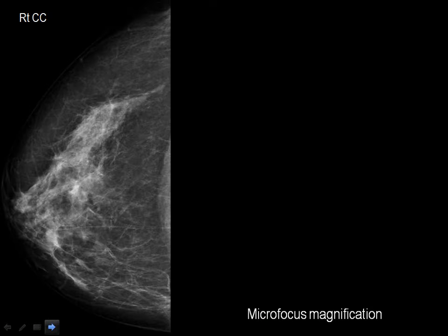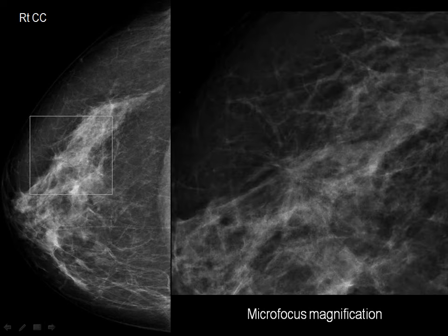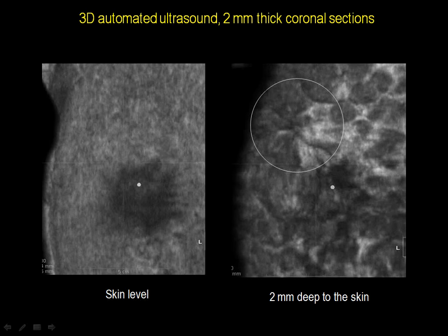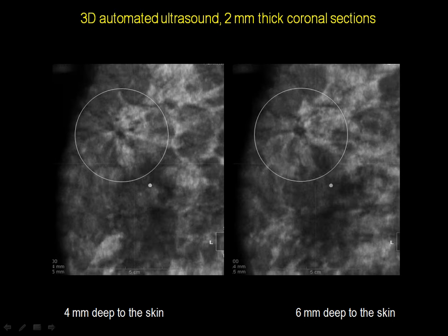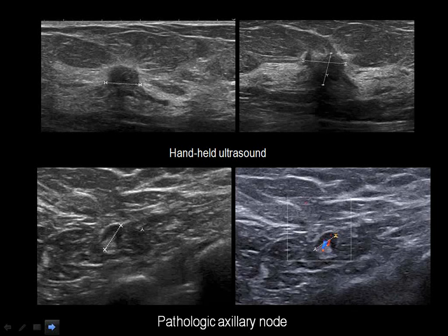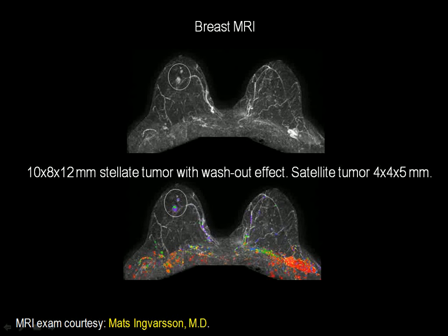We need help on the CC projection — right there the cancer is. It didn't calcify. But using 3D automated ultrasound, it would not only show the radiating structure and tissue defects, but also reveal it's not just one — it's several. Ultrasound proves that it's multifocal cancer, and unfortunately, as we discussed, multifocal cancer is a poor negative prognostic factor. There is a lymph node metastasis.